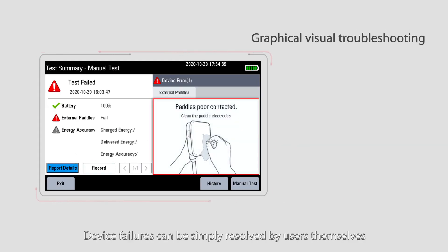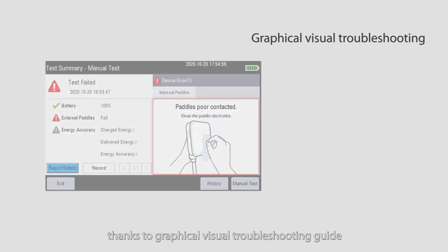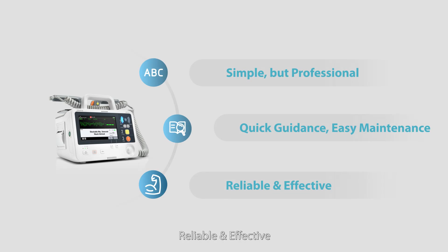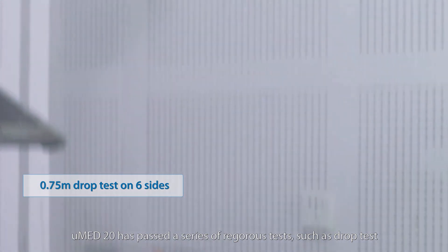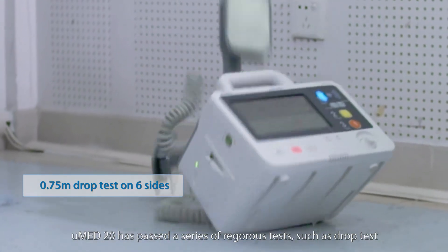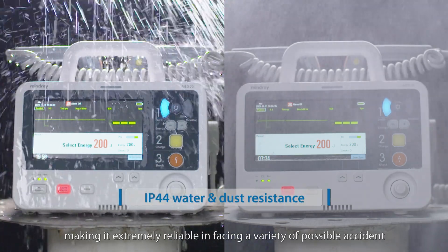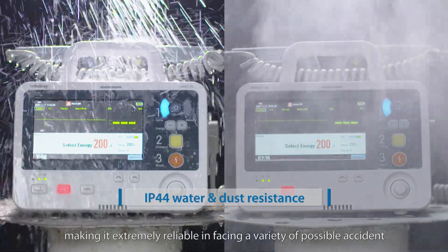Device failures can be simply resolved by users themselves, thanks to a graphical visual troubleshooting guide. Reliable and effective — UMED20 has passed a series of rigorous tests, such as drop test and water and dust resistance test, making it extremely reliable in facing a variety of possible accidents.